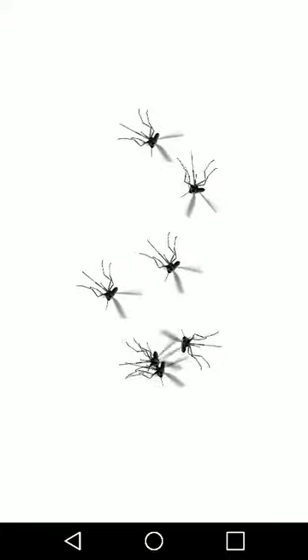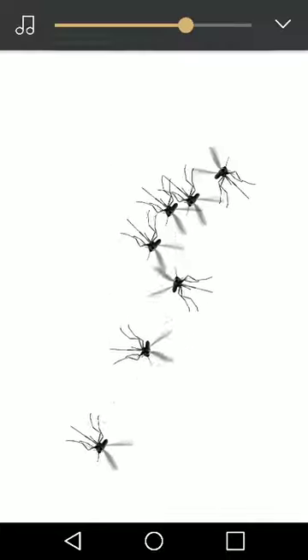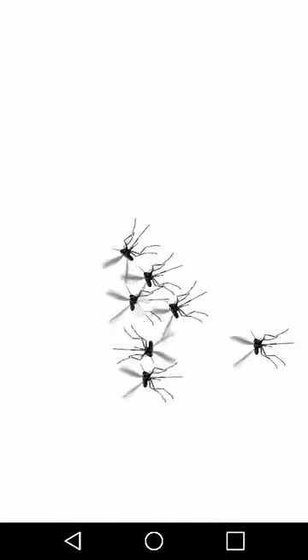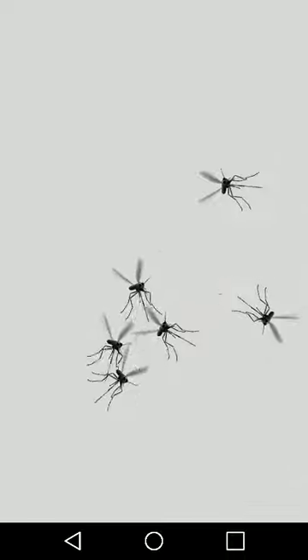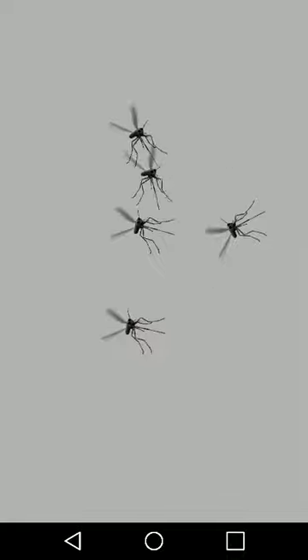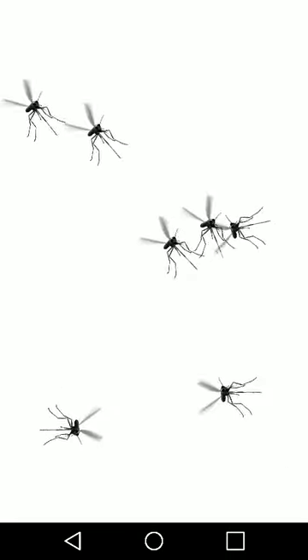Every time we kill a mosquito, the contrast gets less and less. So it starts off easy and it gets harder and harder. And so we're right down to the last one. Where are you? Gotcha. Then we move on to the next challenge.